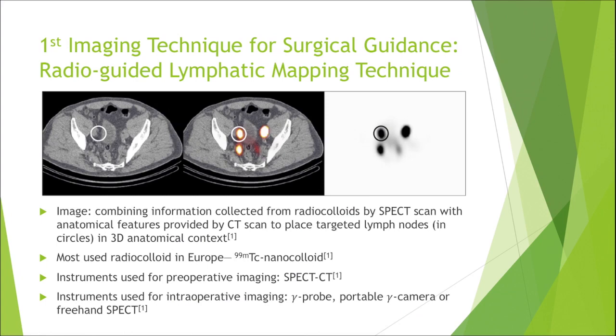The reason why this particular radiocolloid is used is because we want prolonged retention in SLNs so that the radiocolloid won't further migrate into higher echelon nodes. 99m technetium nanocolloid has a large mass, which is suitable to achieve such retention level. However, rapid visualization after injection is also desired. Due to its slow movement, it will also elongate the waiting time between injection and imaging.